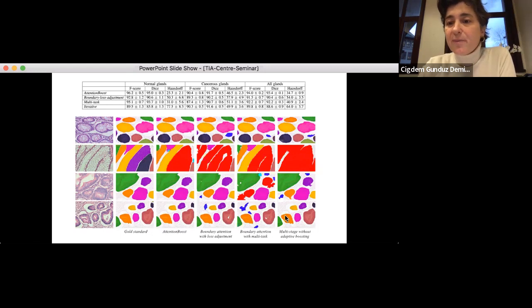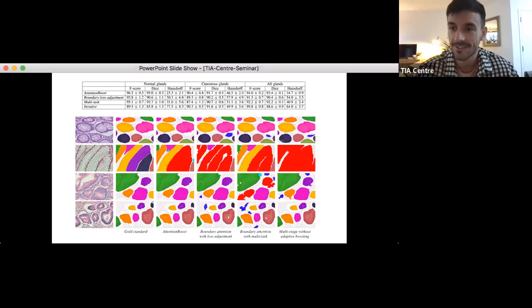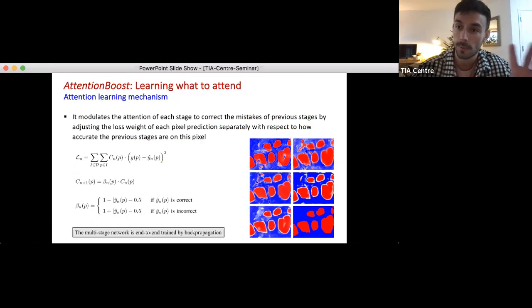So, okay, Simon, you raised your hand. Yes, I have. I thought I'd ask a quick question if that's okay. Sure. So when determining this weight map, I'm guessing that it's calculated by looking at the output probability map and also the ground truth.